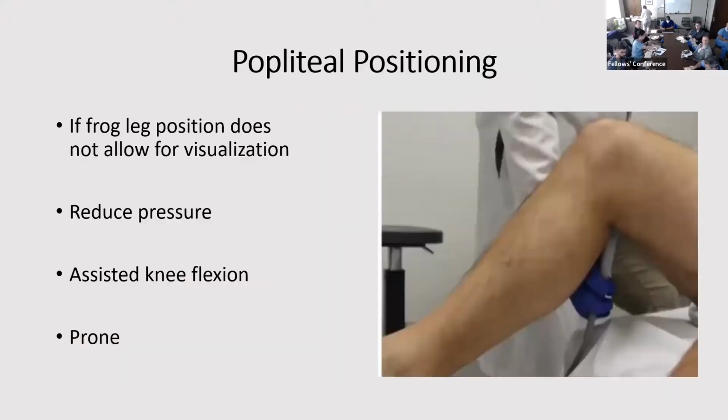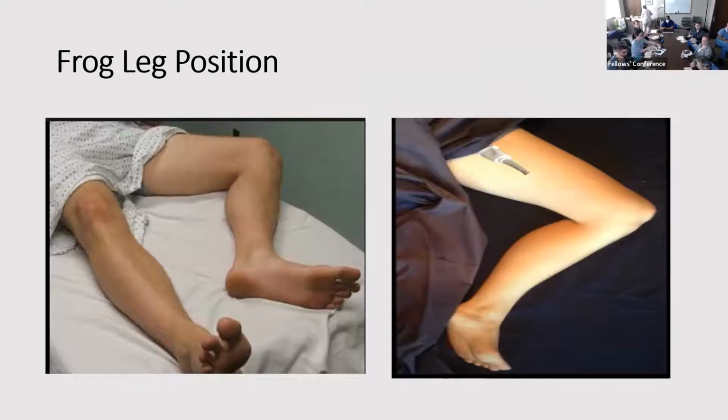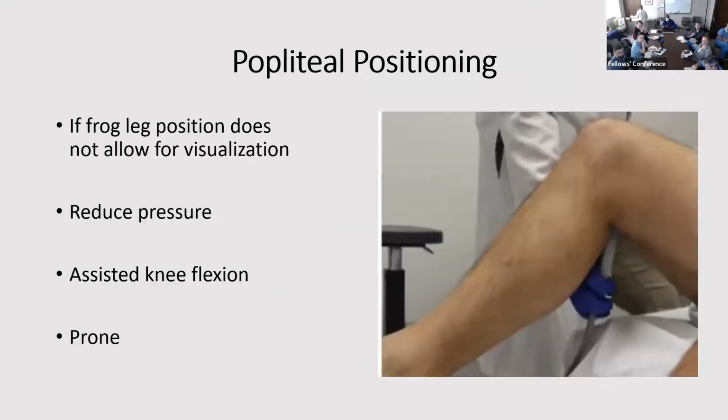So that doesn't change the bend, like if you're putting in a line, you're still very sharp, so it's probably going to straighten it out for you. So we also have another vessel that we need to look at. That's the popliteal. The positioning of the leg to identify the popliteal vein can vary. If you have a patient that has a larger body habitus, you can run into some significant trouble seeing this vein. I typically start in a frog-leg position. I try to do my scan.